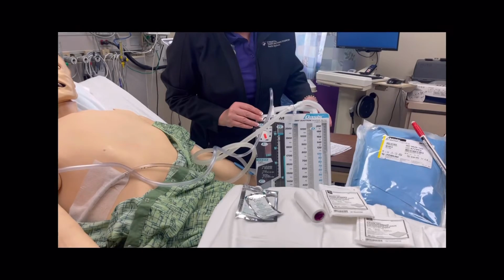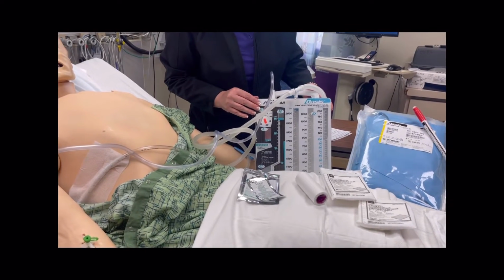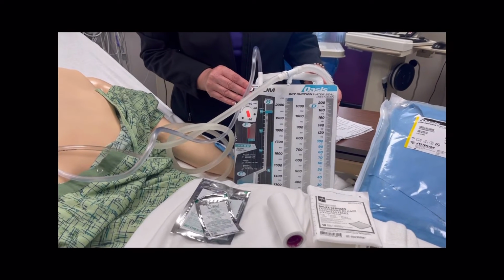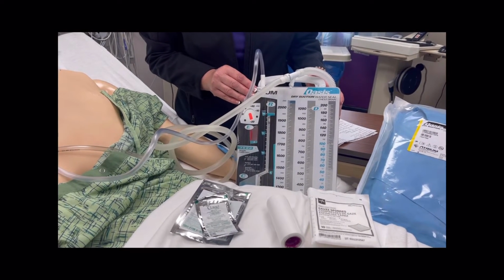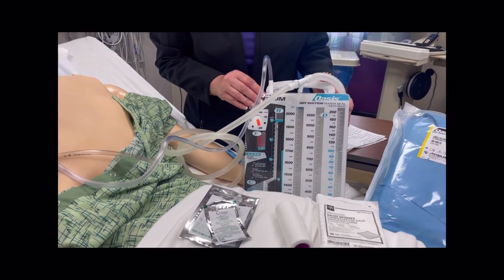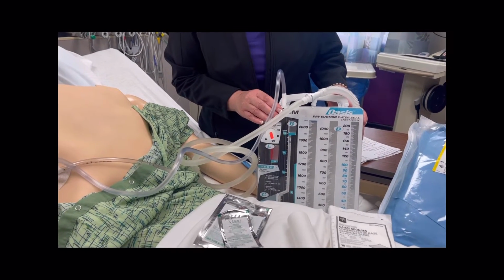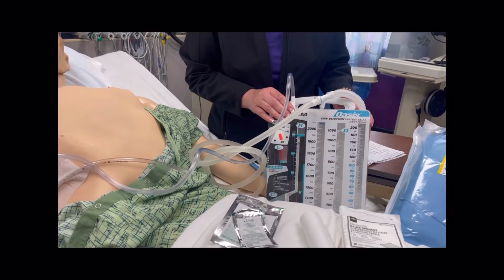We do just a couple of things. We do not take patients off suction. They have to have an order to be on water seal. We'll talk a little bit more about that, but they stay on suction until there's an order for them not to be on suction. And again, you have to check your orders.